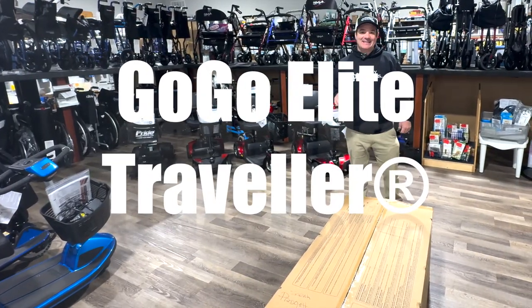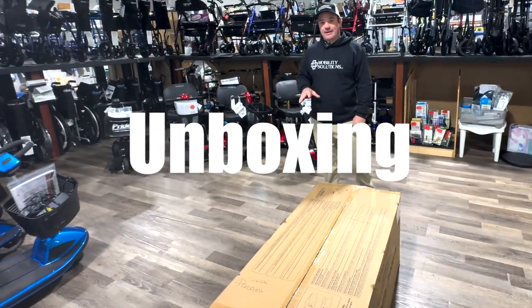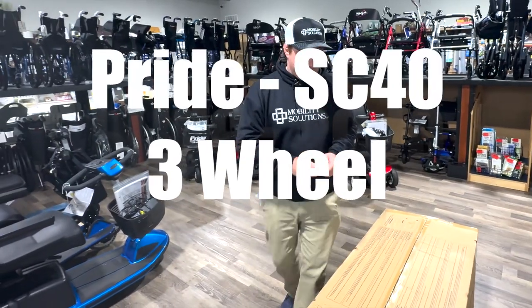We're going to unbox the GOGO SC40. This is the Elite Traveler with standard batteries.